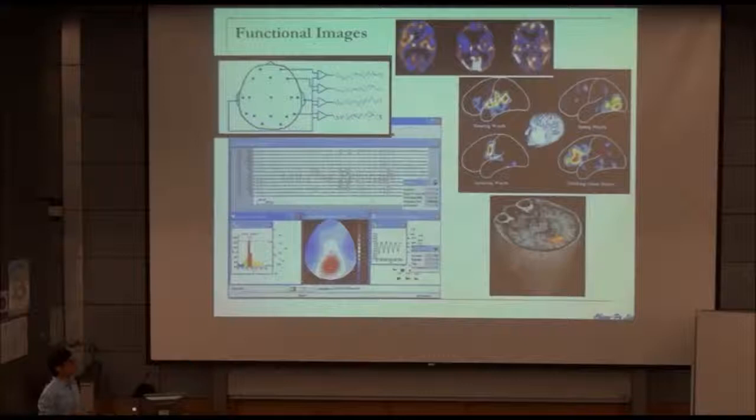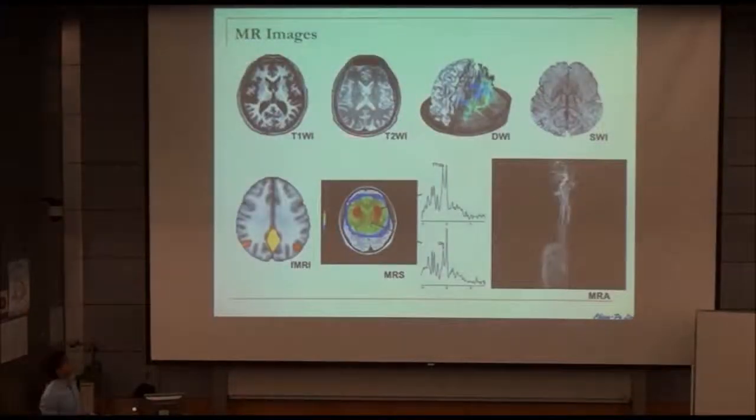We need MR. So here is the MRI. Actually, MRI shows different kinds of contrast. For example, T1 and T2 are kinds of physical characteristics. So for us, the idea is to differentiate the brain structure just based on their physical properties.